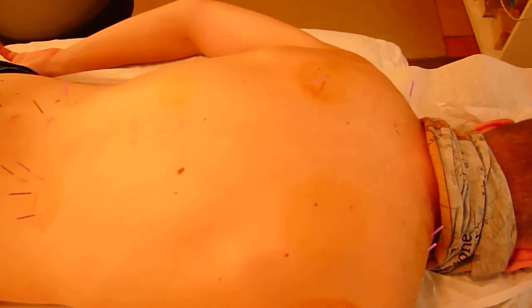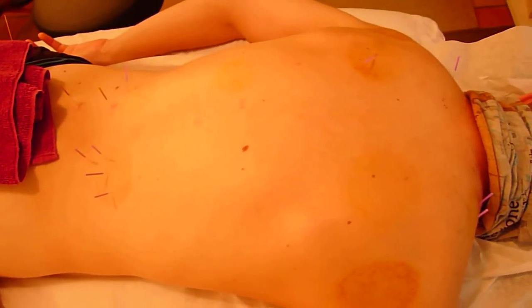I've released the trigger points on the upper trapezius, and his rhomboid on the right was fine — I did the rhomboid and upper trapezius on the left. That's what I'm doing with him, and he's already doing a lot better.